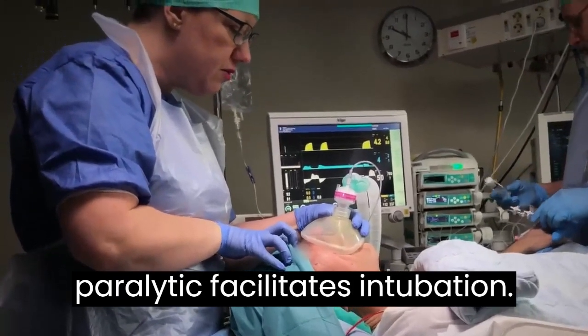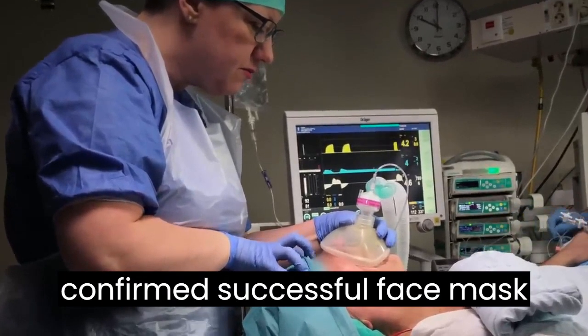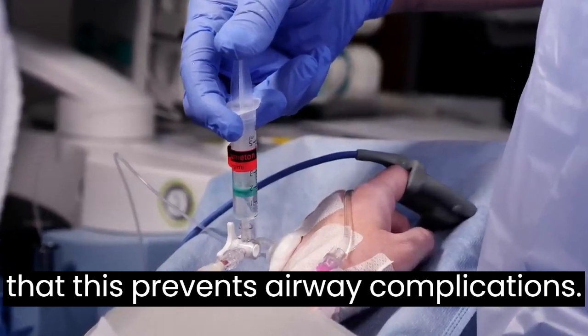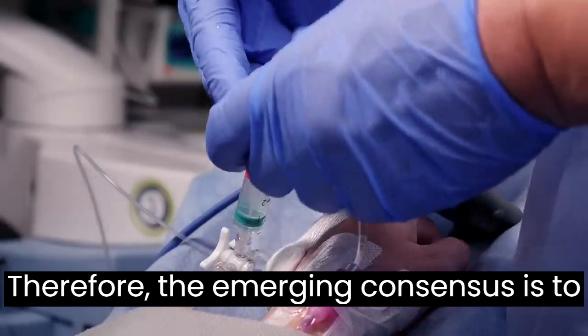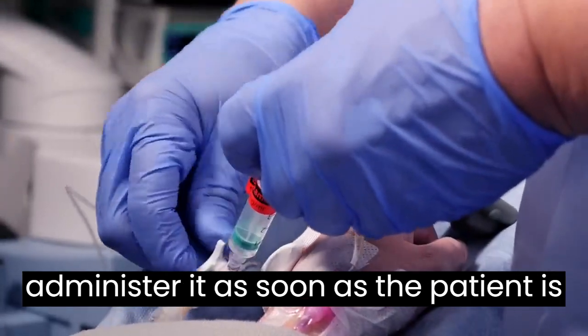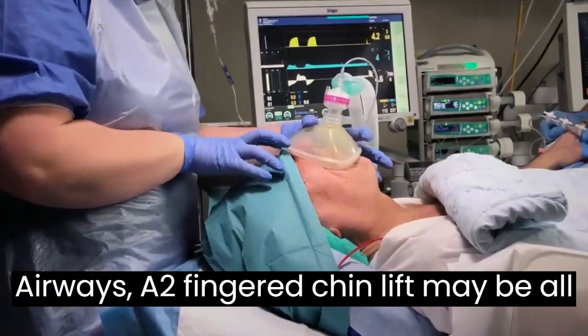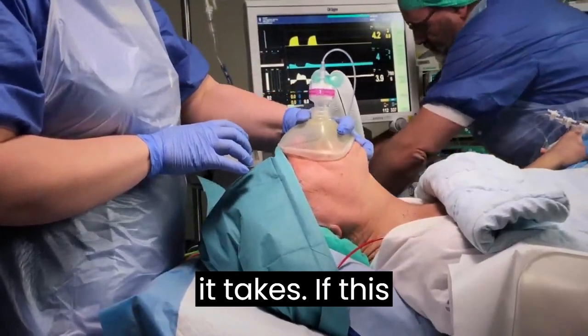A paralytic facilitates intubation. Traditionally, we would first have confirmed successful face mask ventilation, but no evidence has shown that this prevents airway complications. Therefore, the emerging consensus is to administer it as soon as the patient is unconscious. Open the airways. A 2-finger chin lift may be all it takes.